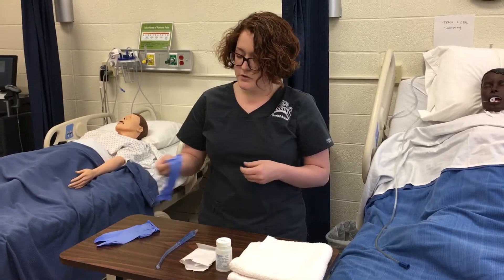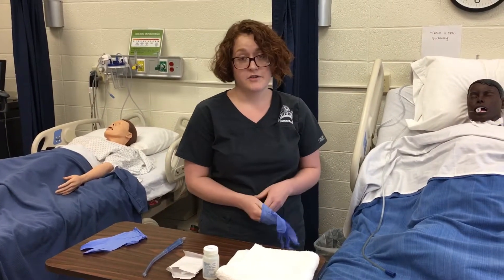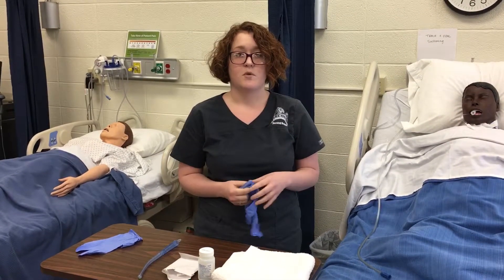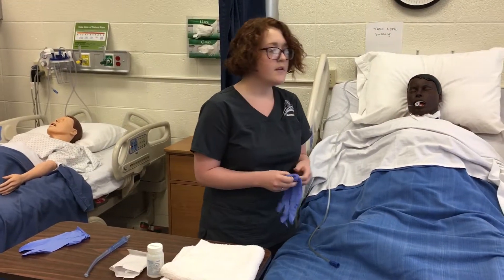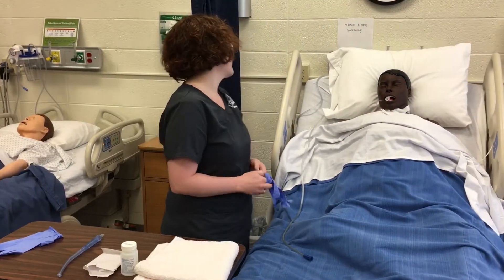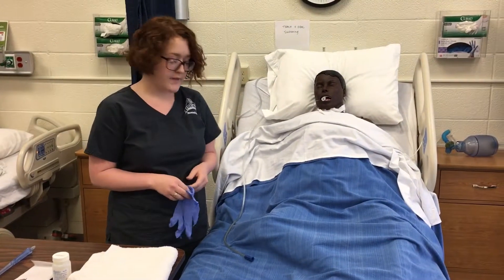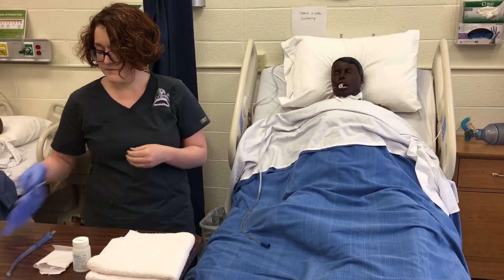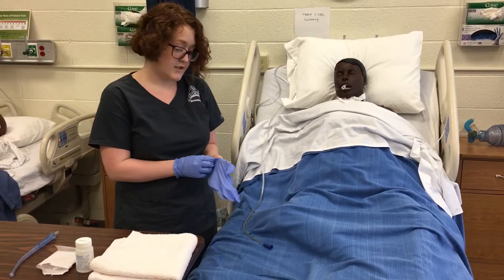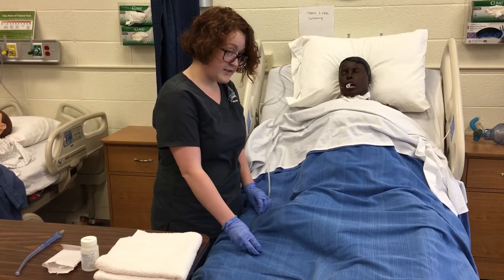I'm going to perform hand hygiene, go in and introduce myself to the client, identify them with two identifiers, and explain what I'm going to be doing. I am going to turn on the wall suctioning to 80 to 120 millimeters of mercury. After performing hand hygiene I'm going to don my gloves and test the wall suctioning — it's working just fine.